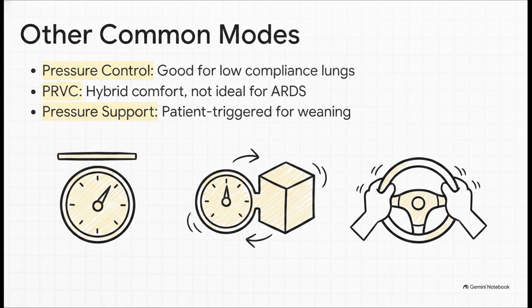Finally, we have pressure support. This one is entirely patient-triggered, no backup rate whatsoever. Pressure support is basically your extubation test drive. It lets you know if the patient actually has the stamina to fly solo once you pull that endotracheal tube out.